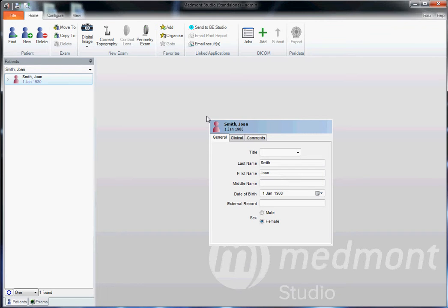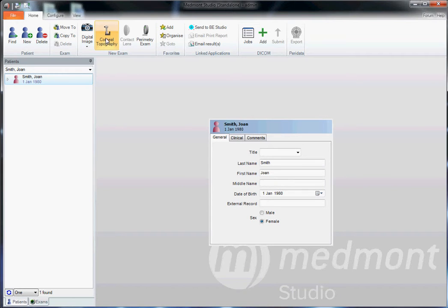This video reviews the basic operation of the Medmont E300 corneal topographer. Start by creating a new patient or finding an existing patient. Once selected, click on capture corneal topography.